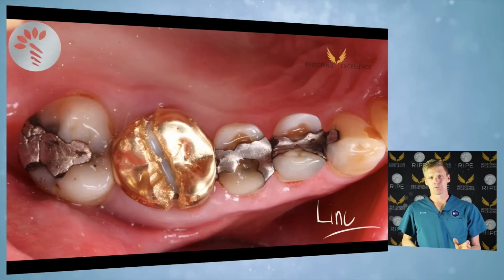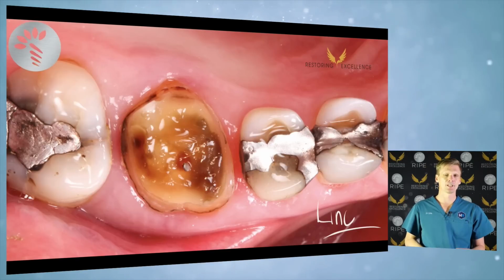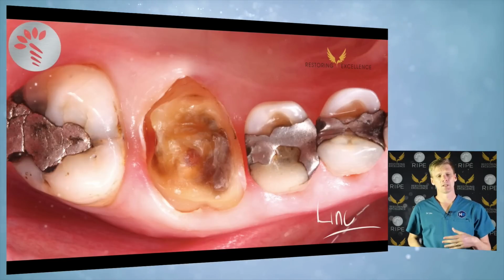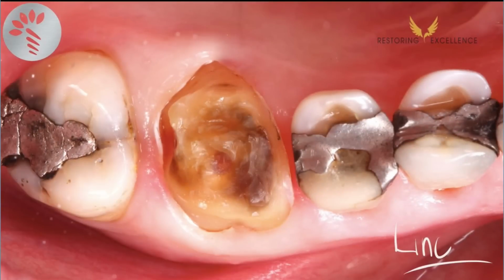You'll notice that this is just a repetition. It's just the same thing over and over. We take it out, okay? That's super deep subgingival there on the lingual and the distal. That's why we're replacing the crown. So in this particular case, I've packed Teflon just to do the core buildup. I wanted the most retraction I could get, and I wanted compression of the tissue to stop bleeding.